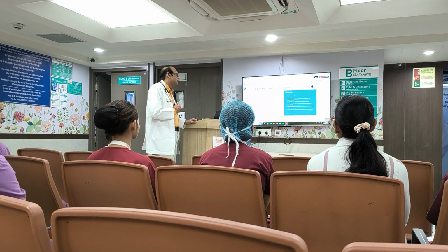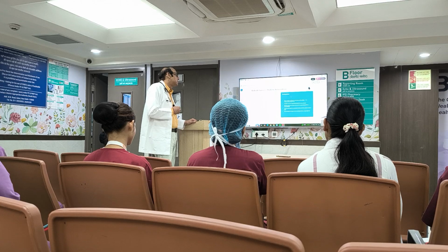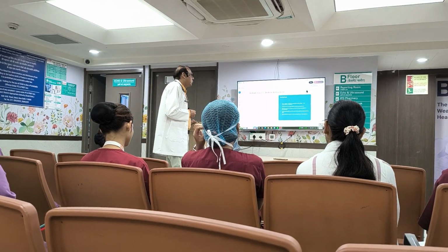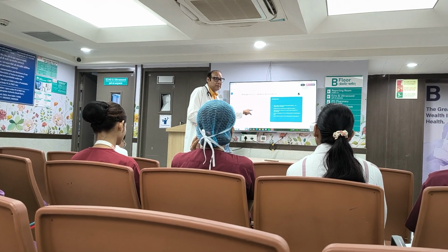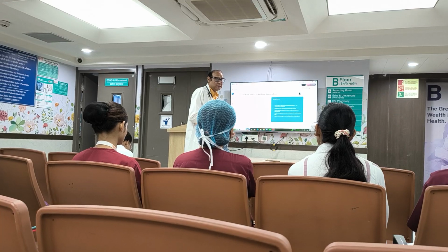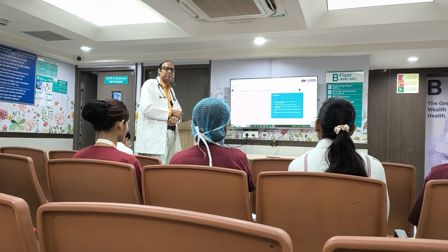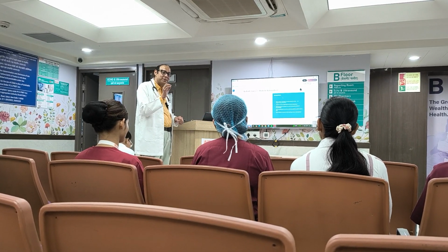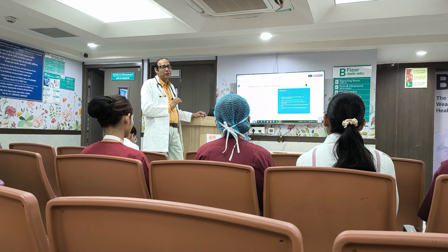इसका इंटरप्रिटेशन बताओ क्या है? पीएच इज 7.18 एंड PCO2 इज 20, बाइकार इज 9 एंड PO2 9. ये कंपोनेंट वी आर, बाइकार इज 9. दिस इज मेटाबॉलिक वी आर कॉलिंग. इसका इंटरप्रिटेशन प्लीज सिस्टर बताओ क्या है? विदाउट सेइंग आप मुझसे बताओ. ये फर्स्ट इज रेस्पिरेटरी कंपोनेंट है या मेटाबॉलिक कंपोनेंट है? देन यू गो फॉर नेक्स्ट लेवल.